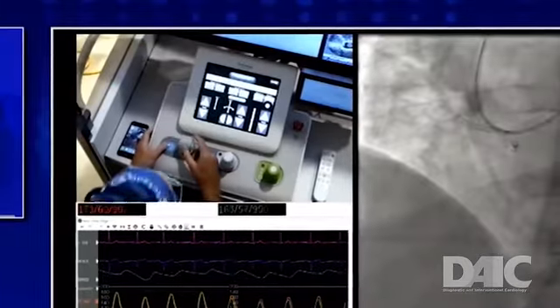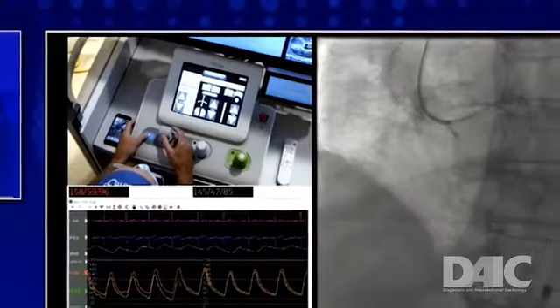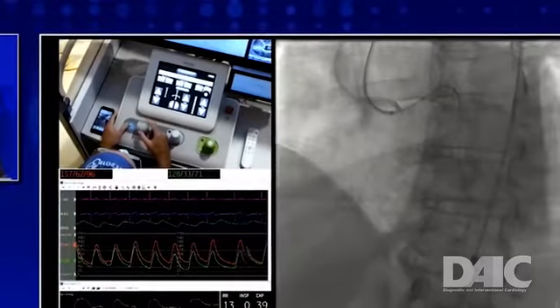And then we went again into the field and we looked and physically saw what are they doing with their hands. So we went into procedures and you watch them as they're doing their cases and can validate what they're saying is indeed what they're doing with their hands. And then we also had physicians measure what they're doing. So measuring things like the speed that they move devices, the rotational speed that they move devices, the torque that they employ when they're manipulating devices, in order to build the parameters of these automated movements.